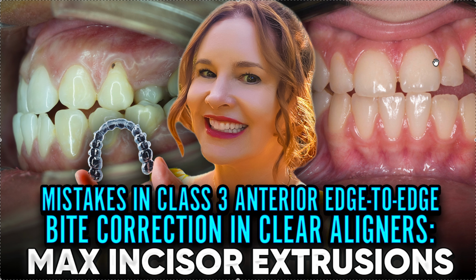If you don't understand why one and why not the other, it's not just an adult versus kids thing. That's not a firm rule. It has to do with the objectives. A Ceph shows us the position not only of the incisors, but the incisors relative to the whole upper jaw, relative to the soft tissue of the upper face and the lip, and relative to the cranial base and the skull and the whole face.